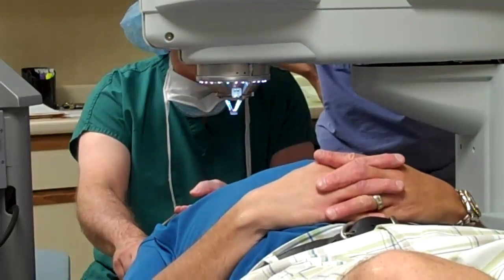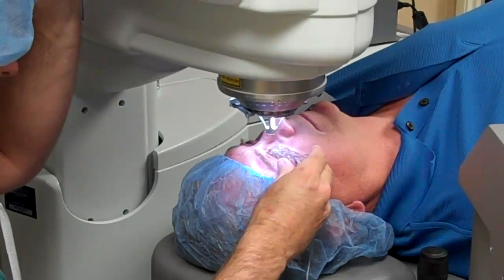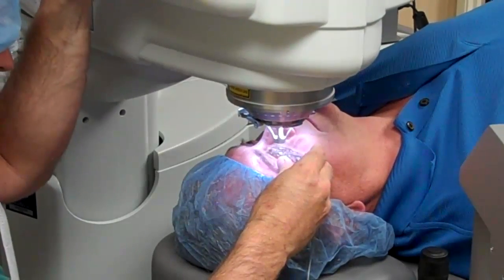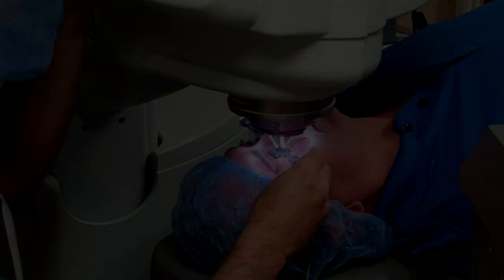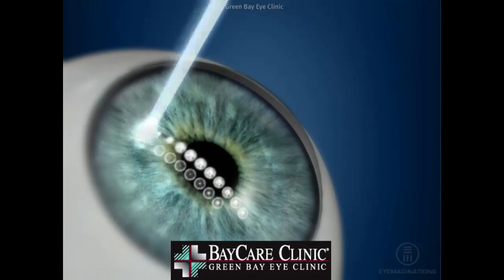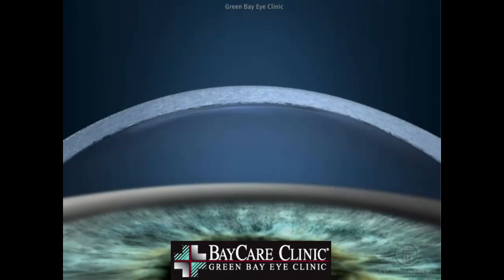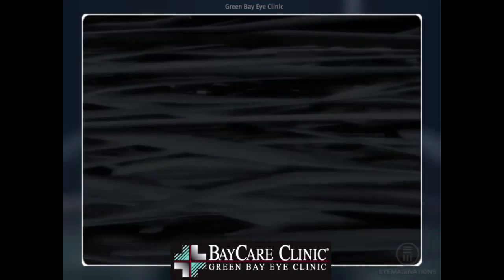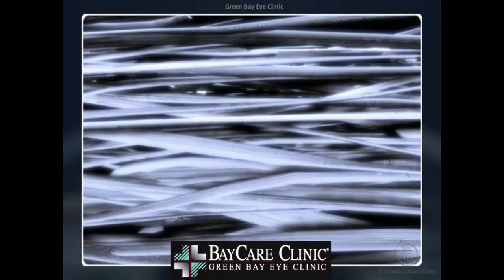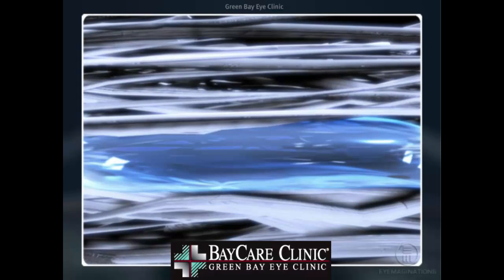The first step is to place a positioning ring and then, we call it dock the intralase cone onto the cornea. The laser is then applied very rapidly. Each very tiny laser pulse creates a burst of energy and creates a carbon dioxide bubble. These will coalesce together and actually create a cleavage plane of the superficial corneal tissue, and that is what is used to create the flap.